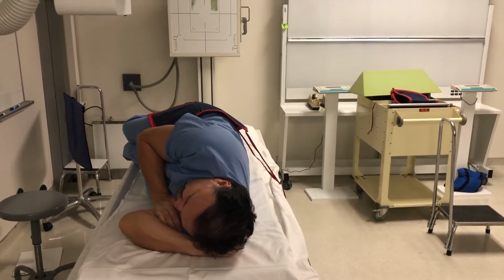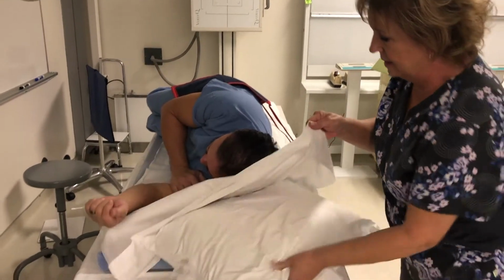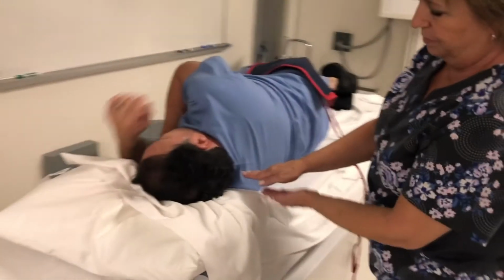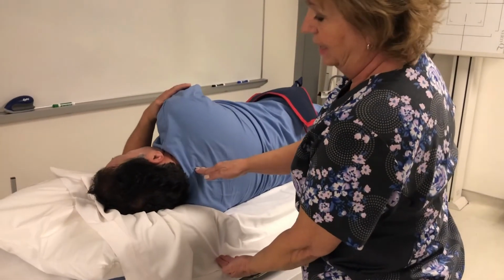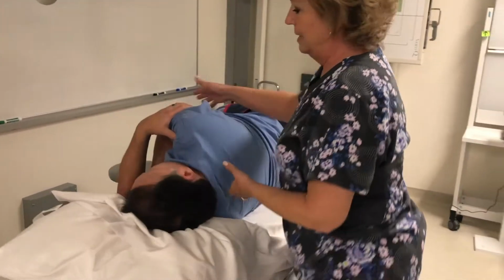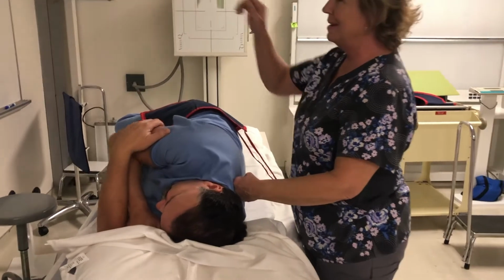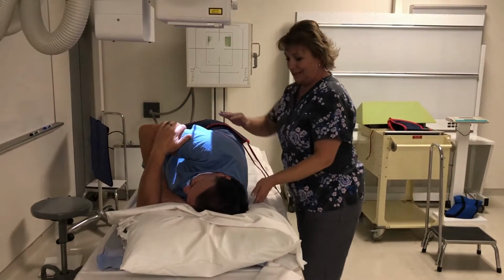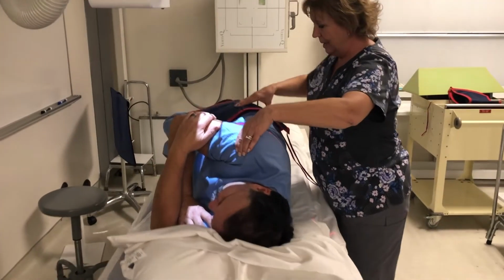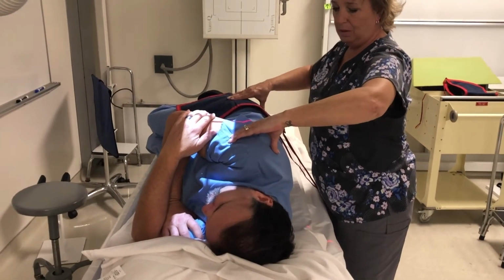Now that he's on his side, I could give him a pillow back, because now his shoulder is creating some distance between him, and if I didn't give him a pillow, his head would be slanted. He's locked his arms in front because he remembered what he had to do from the L spine, so good patient. Okay, I'm going to have shoulders and hips right on top of each other in the same coronal plane.